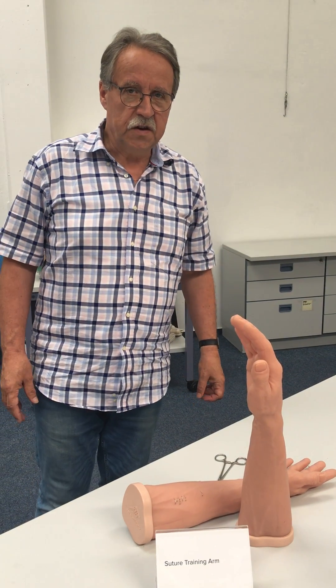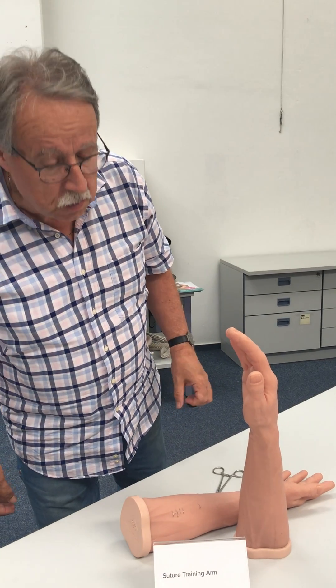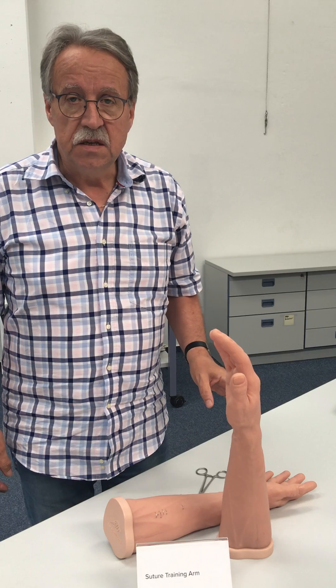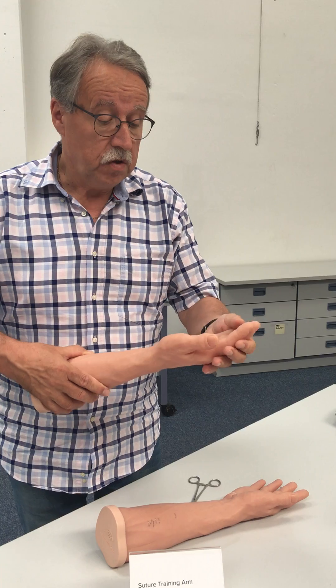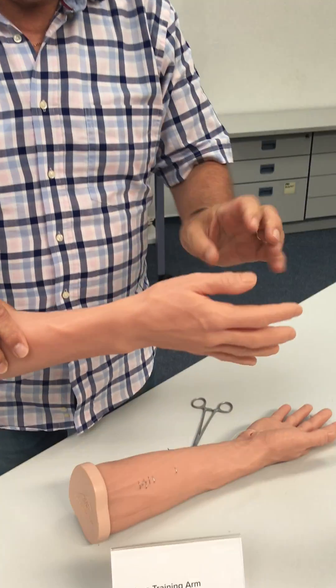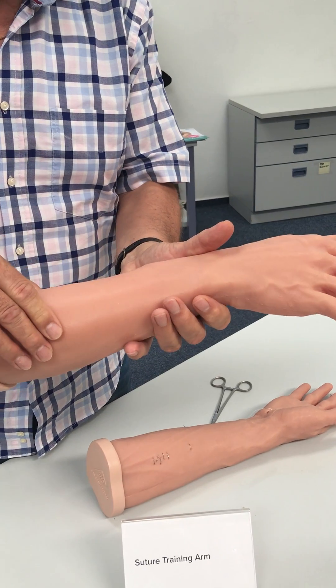Good afternoon. Here we can see our suture training arm P101. It is very flexible and the skin feels really realistic.